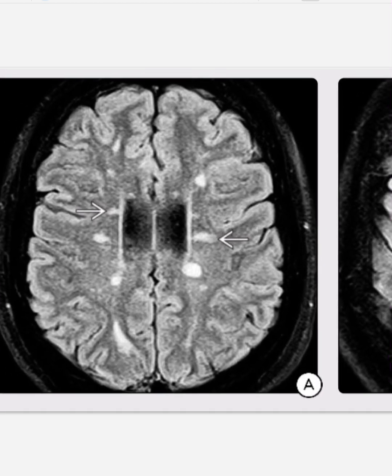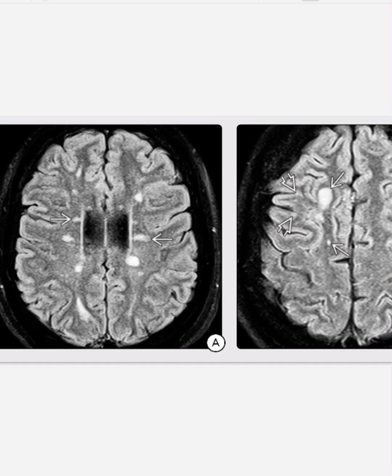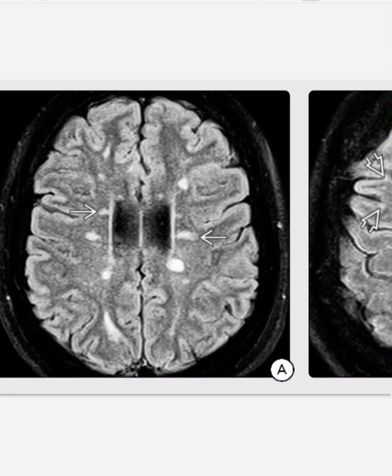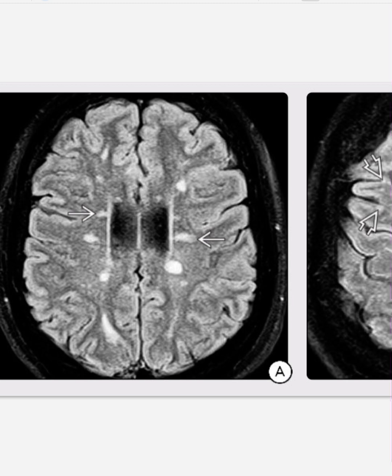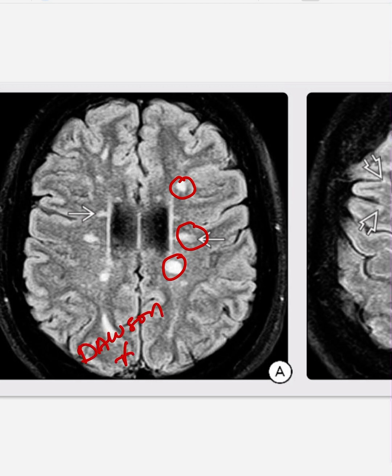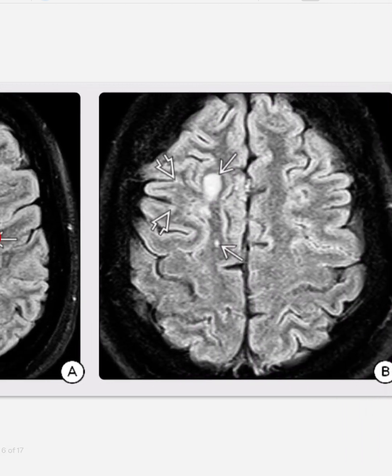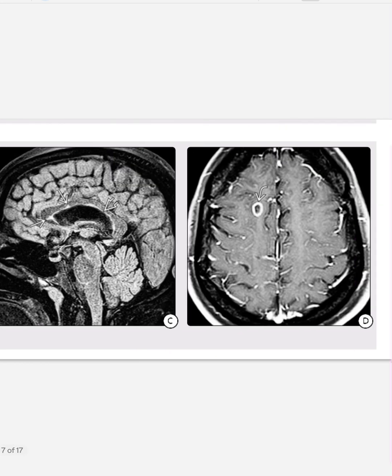Now we will discuss MRI findings. The first case is an axial FLAIR image of a 30-year-old woman with intermittent symptoms of numbness and tingling in her face and hand. It shows multiple subcortical and deep periventricular hyperintensities with perpendicular orientation to the lateral ventricles — this is called Dawson's fingers. The same patient's FLAIR shows additional lesions in the corona radiata with separation and cortical involvement.